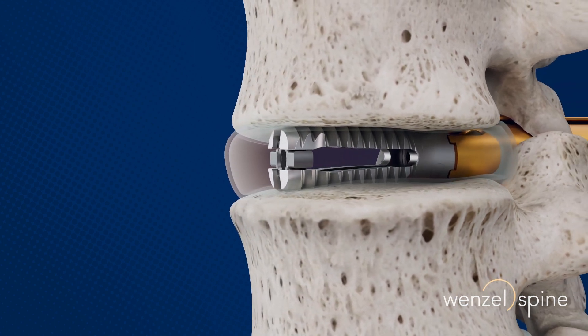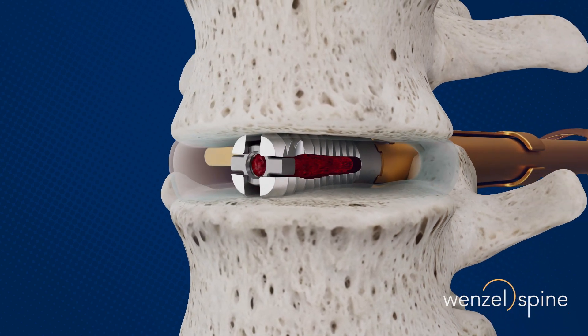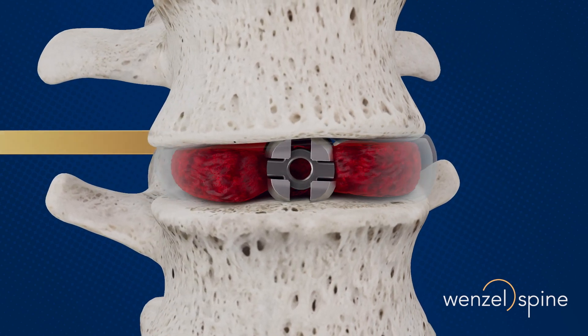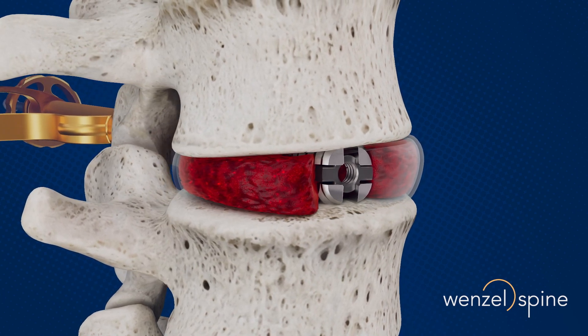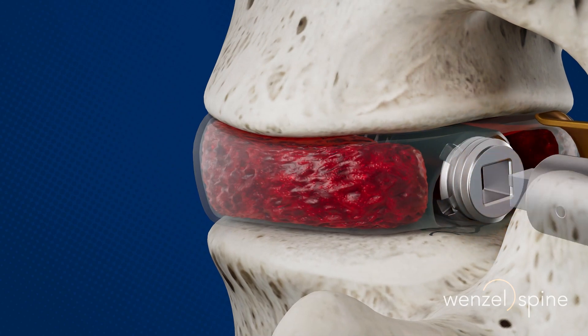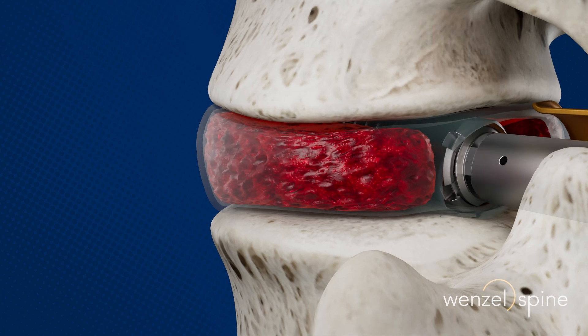Verilift LX is FDA cleared for use with both autograft and allograft. The implant is designed to be post-packed and provides a generous graft chamber for maximum contact between the bone graft and end plates. The end cap provides additional strength to the construct and keeps the bone graft material in place to promote fusion.